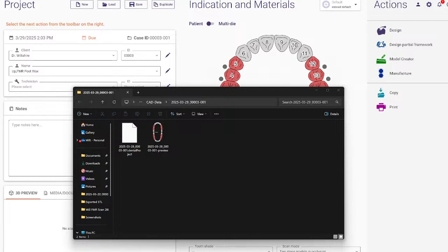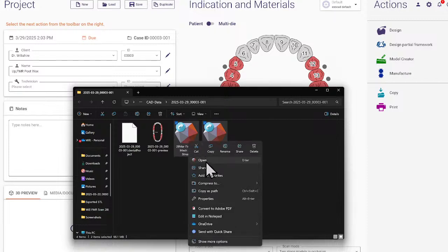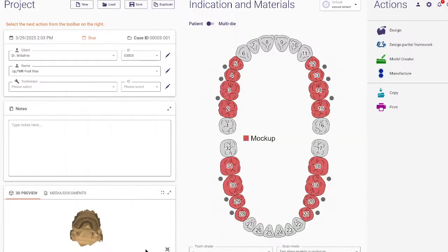So this is my mandibular scan. I just dragged that in. And now I'm dragging my maxillary scan in. Okay, let me just make a copy before, just in case this messes up. So I'll make a backup copy over here. Okay, so now I brought in both of my scans, my maxillary and mandibular scans. So that should be in here right now.